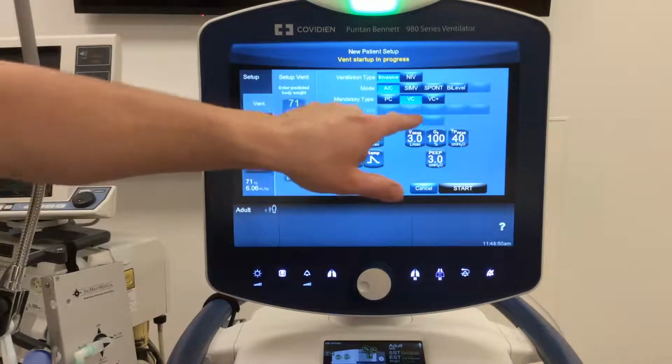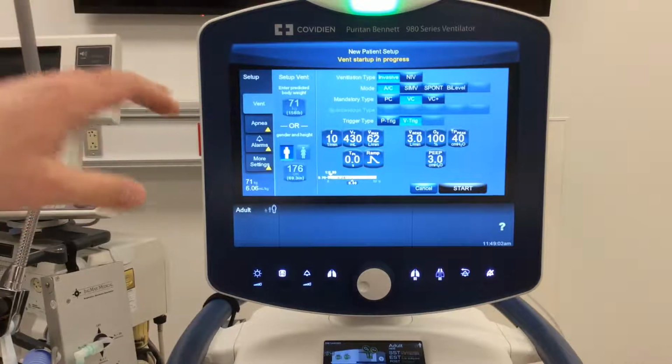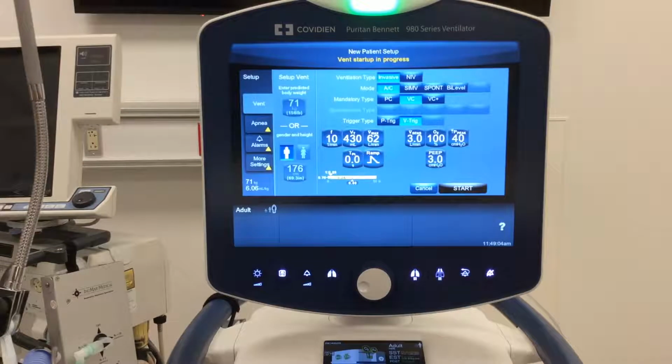Trigger type. We've got V-trig and P-trig, so what we're trying to establish is what that patient is going to have to do in order to tell the ventilator that it wants to trigger a breath. And remember, even as I go through these ventilator settings in a second, just because we set a respiratory rate at 10 or 12 or 20 does not mean that is all the patient can get. We always want to allow the patient to be able to trigger a breath, all right, and get that inspiratory assistance whenever they're telling the ventilator that they want to.